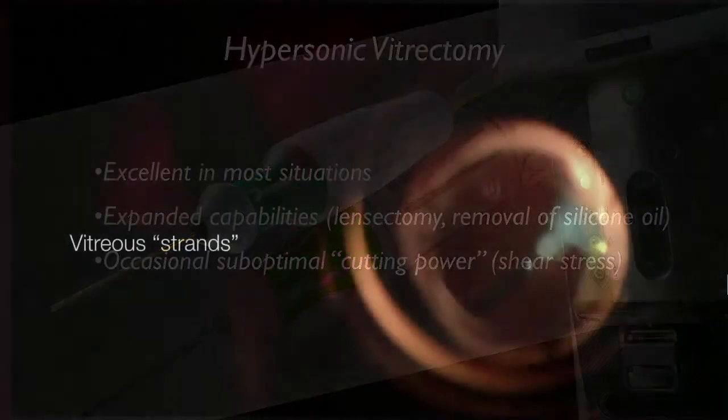It doesn't seem to have enough cutting power, and that's demonstrated in this tendency to sometimes create vitreous strands. I'll show this in slow motion. What we seem to be seeing here is exposure of the native collagen structure of the vitreous. And what's interesting is this doesn't cause any peripheral traction.